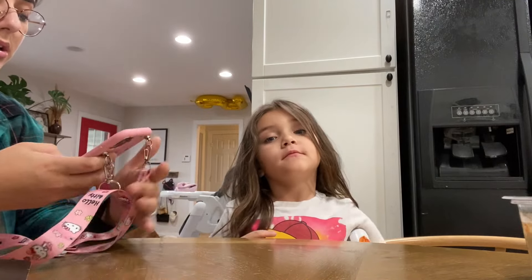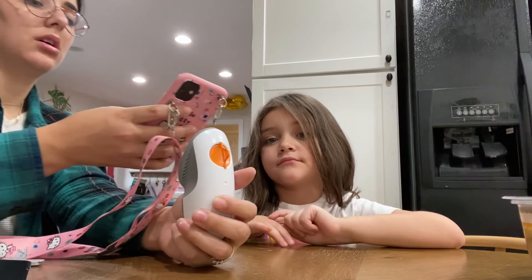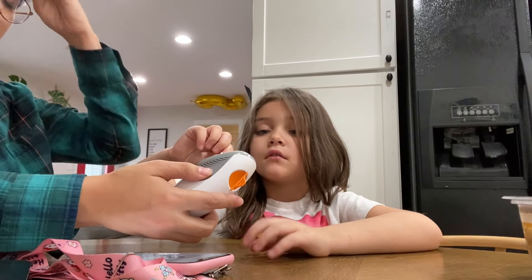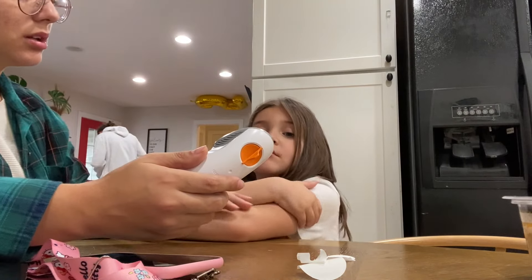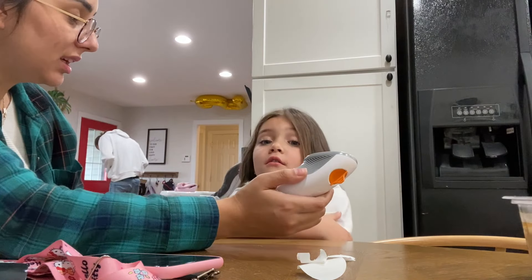Okay, hold on — we gotta put in the code first. Let's take a picture of the code. Put it there. All right, now we can remove the sticker. It's a little itchy on this side.